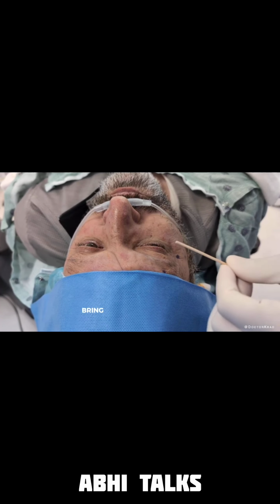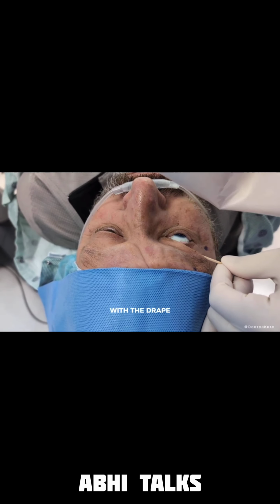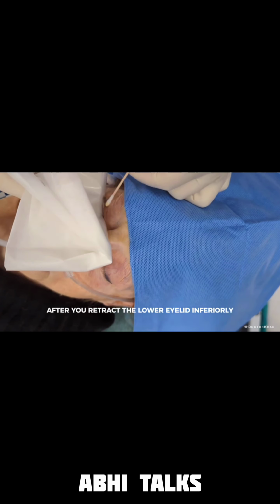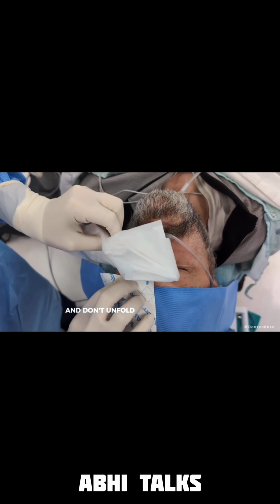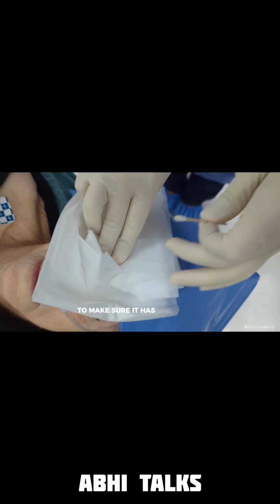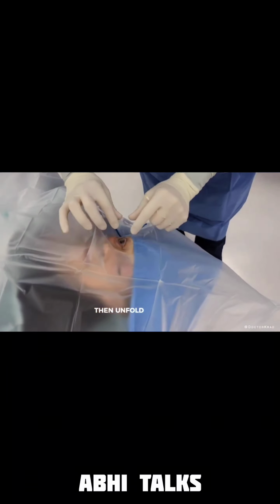Start temporarily. Bring the drape over the eye. With the drape, retract the lower eyelid down. The drape rigidity from the fold is helpful here. After you retract the lower eyelid inferiorly, rotate or roll the drape superiorly over the upper eyelid. Don't unfold the drape quite yet. Before you do that, press down on the adhesive portion of the drape to make sure it has completely opposed the underlying skin. Then unfold the drape.